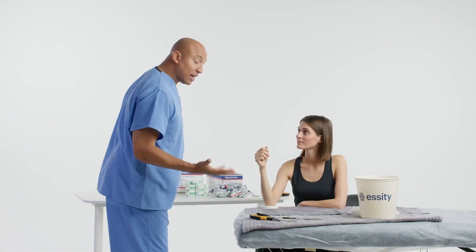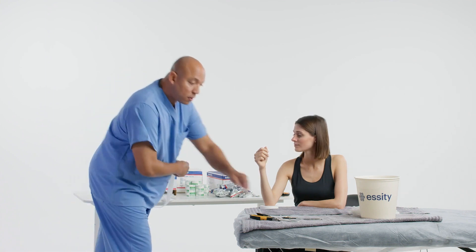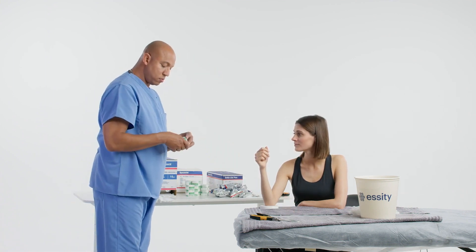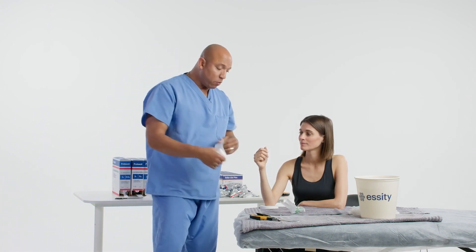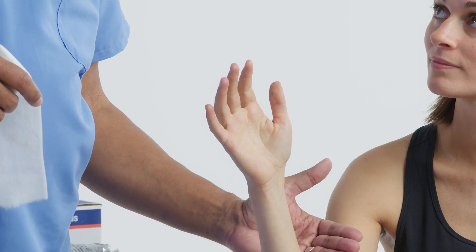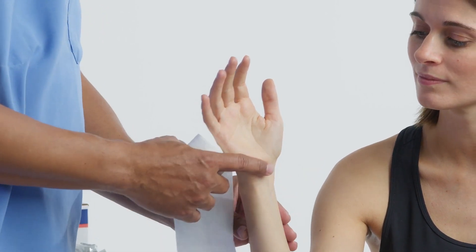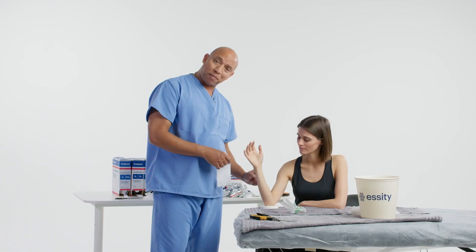Let's go ahead and do our stockinette — we're going to measure for that first. We're going to terminate the cast at the distal palmar crease, and terminate on the proximal aspect maybe one or two inches from the antecubital space, while allowing the patient to bend their arm at least 90 degrees so it doesn't hit the biceps.